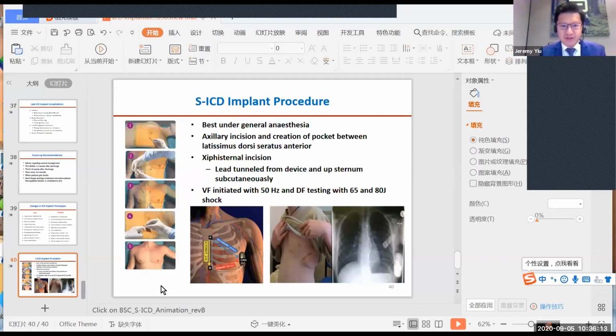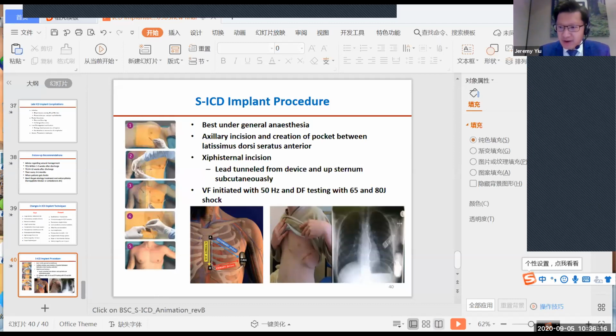Thank you very much, Dr. Yu, for sharing your tips and tricks of implantation. Dr. Chan, do you have anything you would like to add to this topic? Thank you very much, Professor Yu, for sharing your invaluable insights. Maybe just a quick question. In your experience and practice, do you routinely stop the direct oral anticoagulants before ICD implant, or do you allow the patients to continue on this anticoagulation?